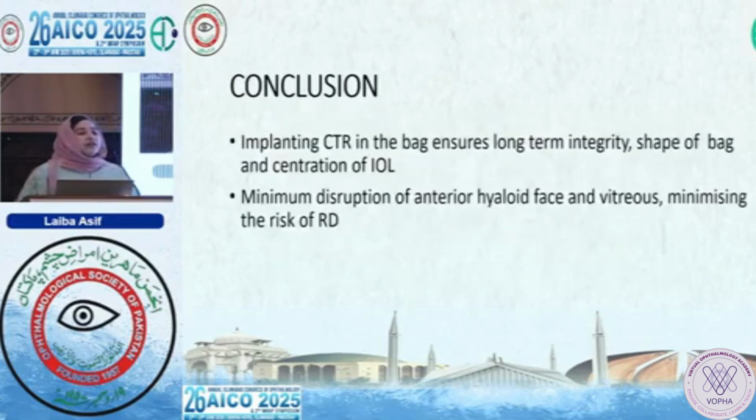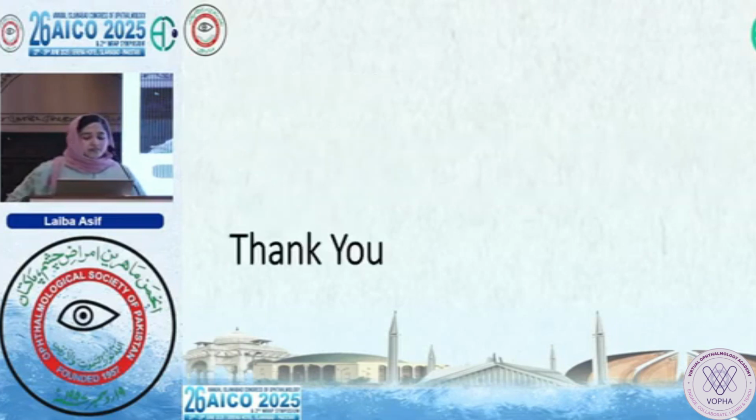So, conclusion: implanting the CTR in the bag ensures long-term integrity, shape of the bag and centration of the IOL. With minimum disruption of the anterior hyaloid face and vitreous, this will minimize the risk of future retinal detachment, especially in a young patient. So this was a novel approach that we thought should be discussed here. Thank you.